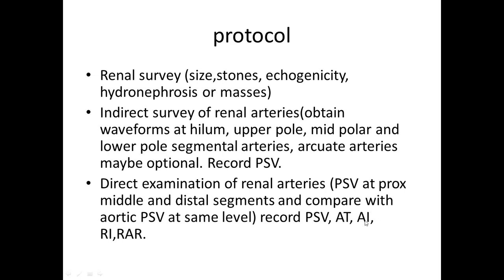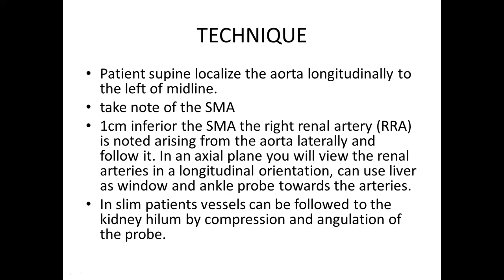This is just the gradient of the rise of that slope on the wave compared to the time on the x-axis. Then the resistive index, we will be looking at the resistive index of all these renal artery segments. And I've talked about it.